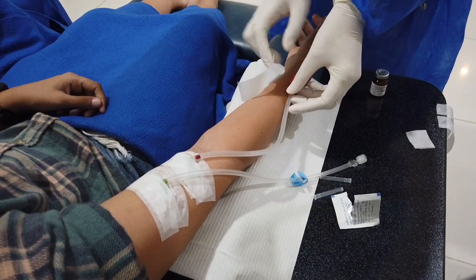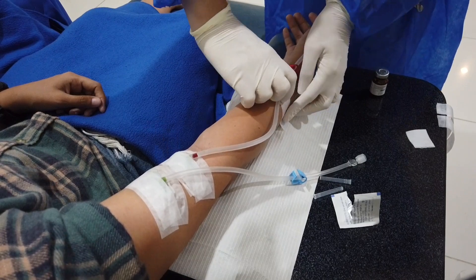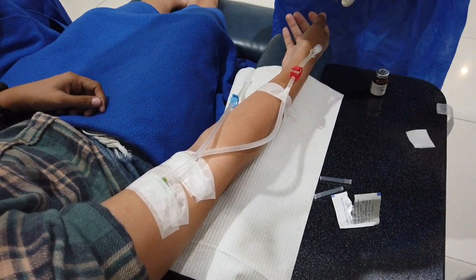Then secure the tubing. I secure it this way to give an allowance and avoid needle dislodgement. Also, nursing is an art — always make everything presentable and pleasing to the eyes.